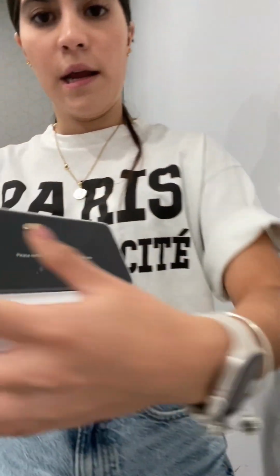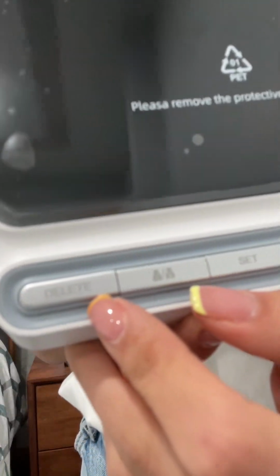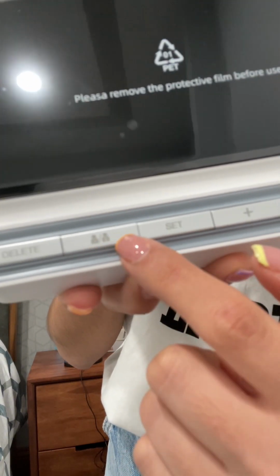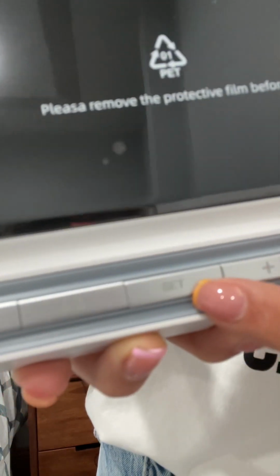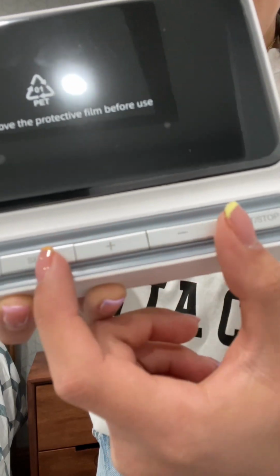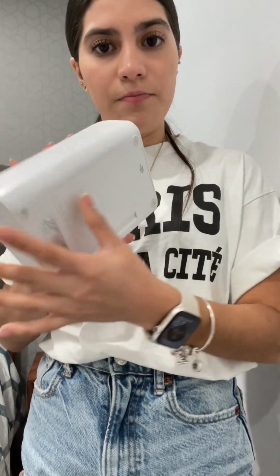So it's like this. We have here the button to delete. We have the user button, that it's this one. I think it's for 2 persons. We have then the setting button. It says set. And then we have the start and stop buttons. And another thing that this blood pressure monitor has is the voice control. So I think it's pretty complete.